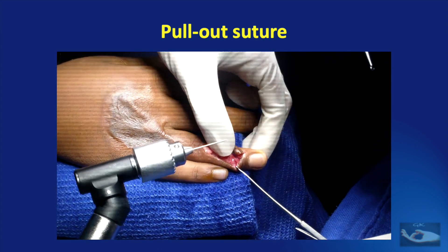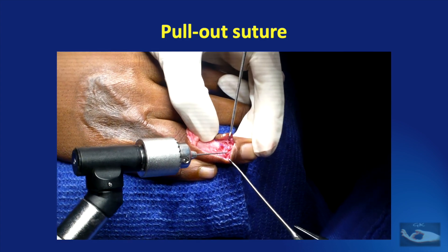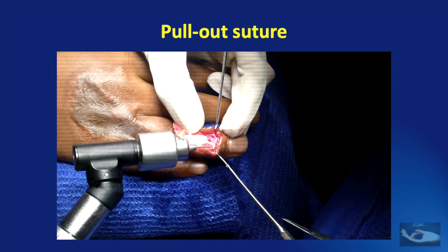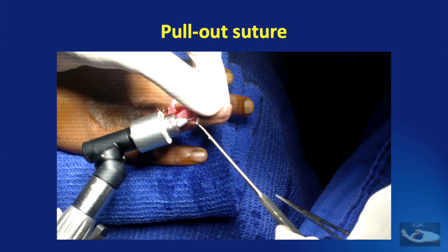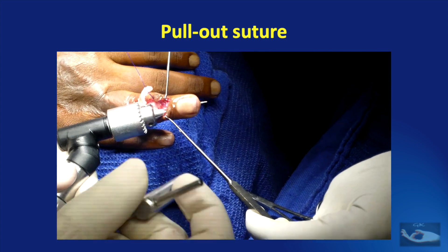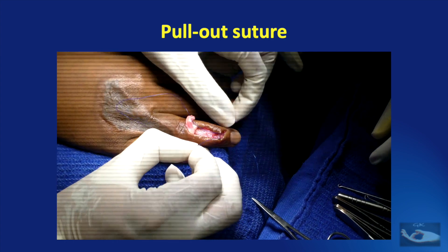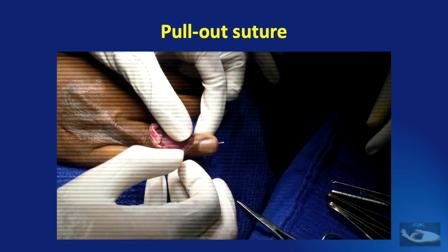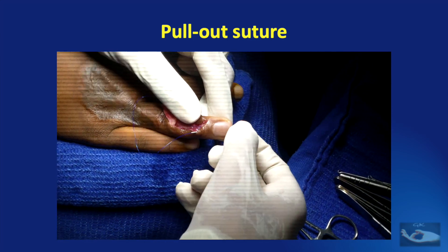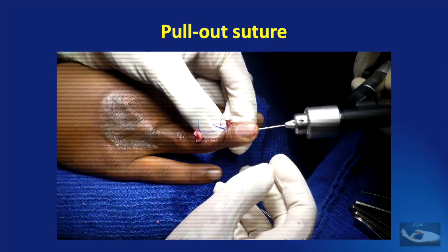Leaving the sutured tendon aside, another longitudinal drill hole is passed just as done earlier, but this time from the ulnar side of the raw area on the dorsal aspect of the base of terminal phalanx. This needle should exit about 5 mm to the ulnar side of the previous hole. The needle is cut from the suture and the free end is then threaded through the recently passed needle to exit at the tip of the finger alongside the previously passed suture. The needle is then removed with the help of the drill.